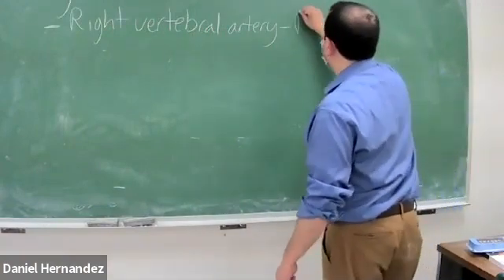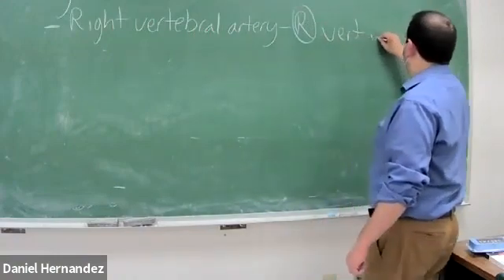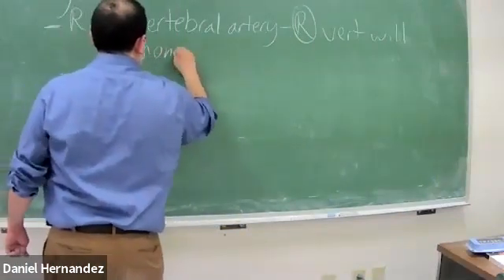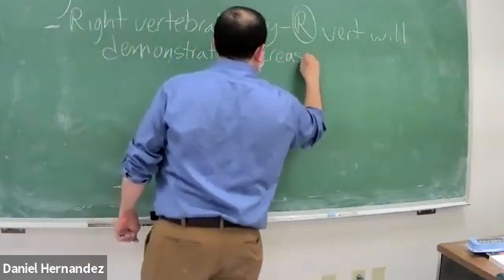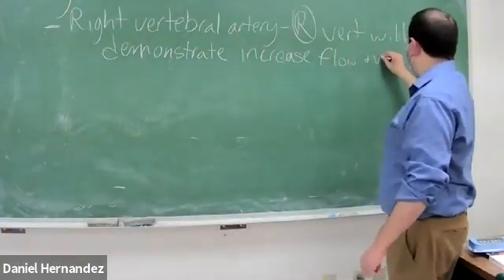The right vertebral artery will demonstrate increased flow and velocities.